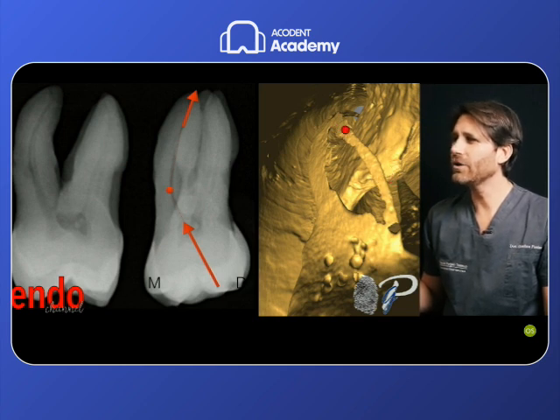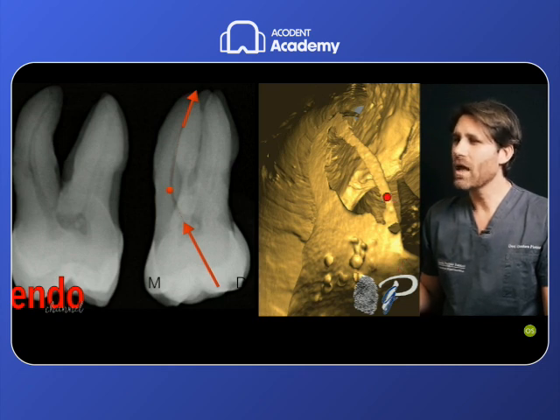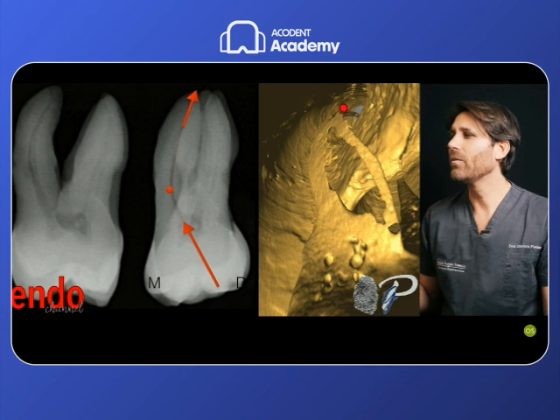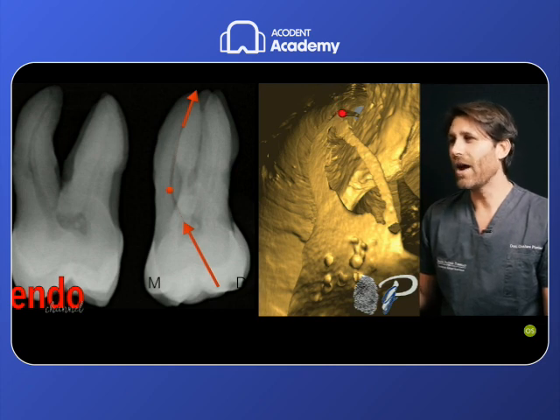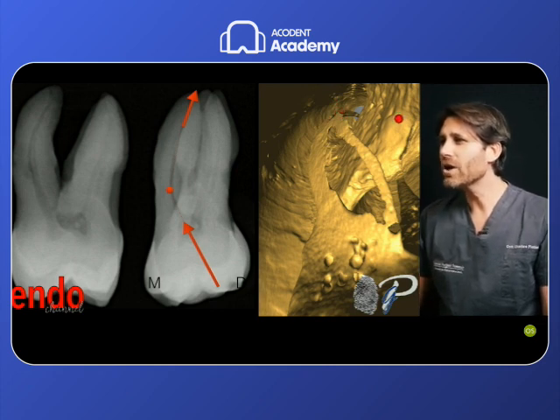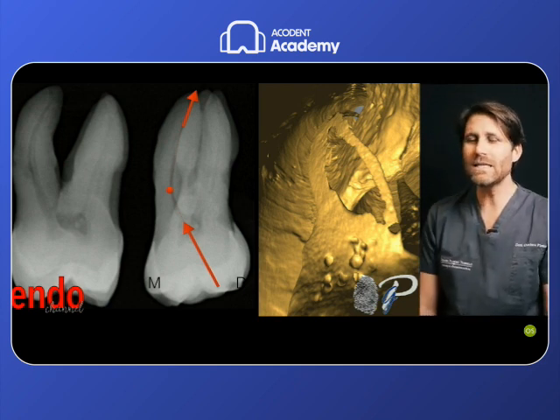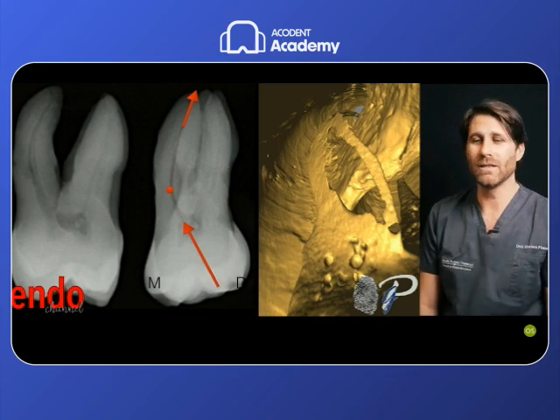This is the furcation, and this is the trajectory, a trajectory that goes mesially in the initial part, and also buccally in this case, and there is a point here before the conjunction with the main root canal, in which the root canal goes distally after the curvature. This is the anatomical complication that we have to deal with in scouting these canals.